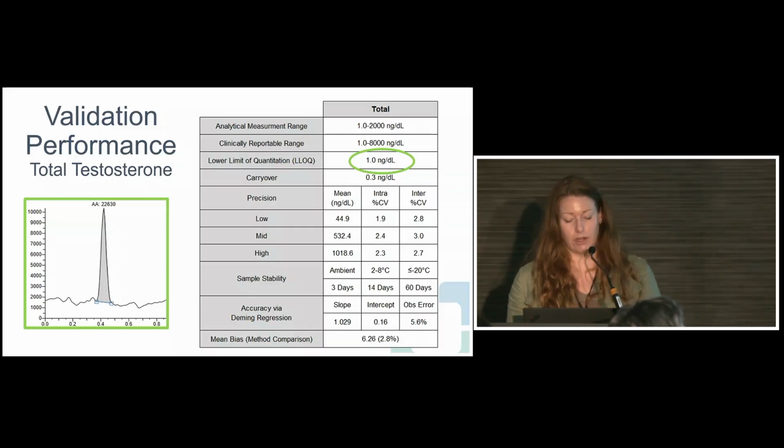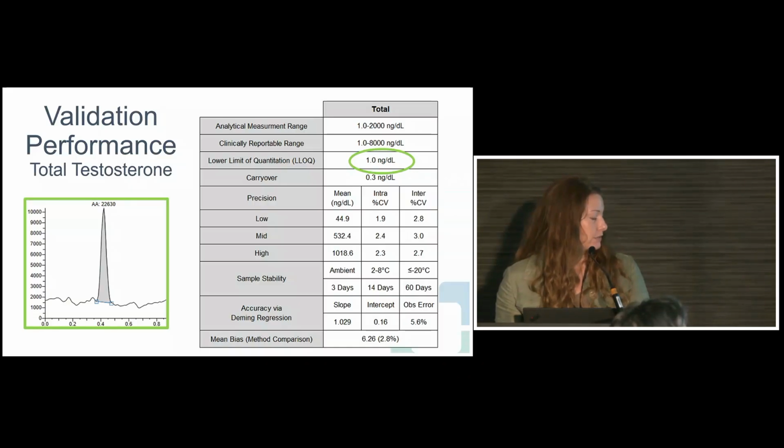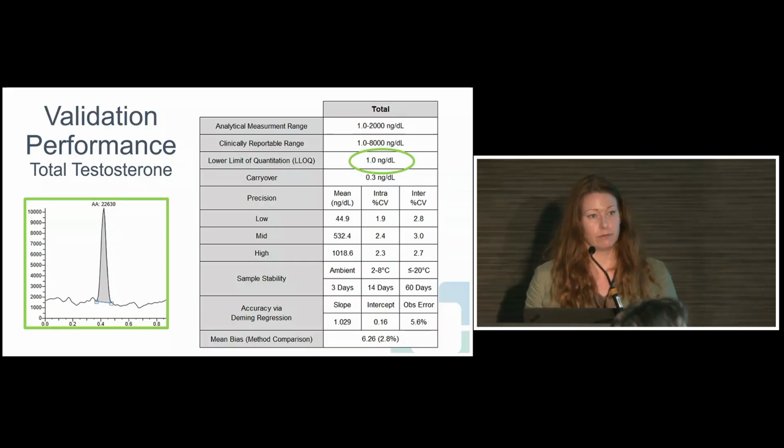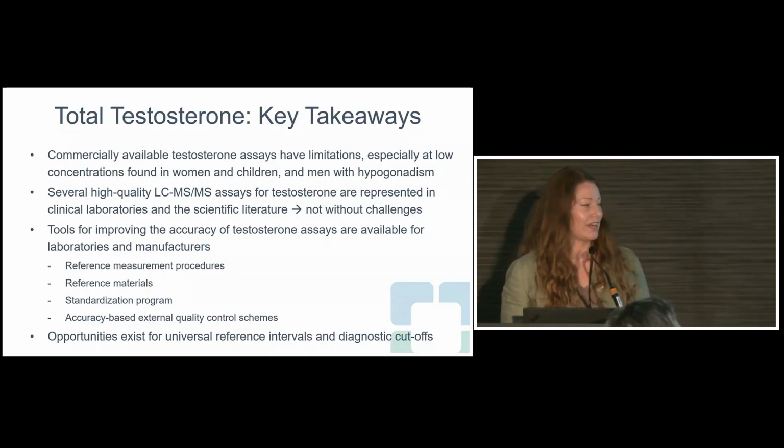A very low carryover with this method in the wash after the end of the gradient, and we have really good signal for our LOQ. And we compared, again, with a reference lab with a bias of 2.8, and that is separate from the CDC. So I will give it back to Jessica.